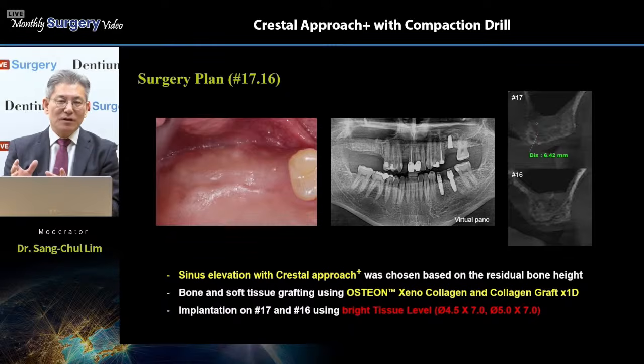For example, 7 millimeter means 7 millimeter treated surface plus 1.5 at the metal collar, and then totally 1.8 millimeter the hex portion. So 3.3 is added to 7 millimeter. So from the tip to top, total length will be 10 millimeter, right? Exactly 10.3 millimeter. So we have to consider the total length of the fixture compared to the bone level implant system.